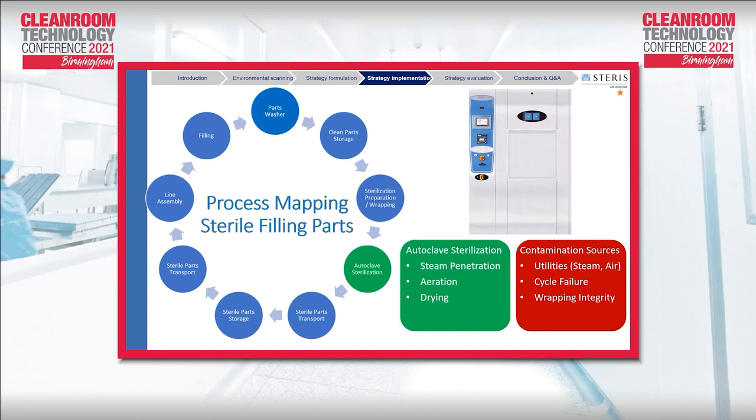Sources of contamination may be inadequate steam supply or presence of air, so inadequate removal of the air, cycle failure that may lead to improper sterilization, wrapping integrity, for example, if it is not adequately wrapped, and then you have burst of the wrapping or water on the wrap that creates a barrier to the sterilization process.